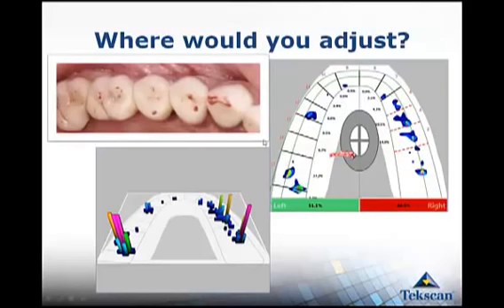Let's look at another picture here. Again, if you were to look at tooth 15, which is right there, versus tooth 12, where would you adjust? Would you adjust here? I would say most people would probably look at doing some adjustments there.